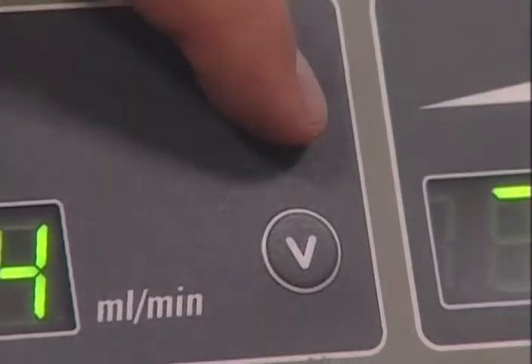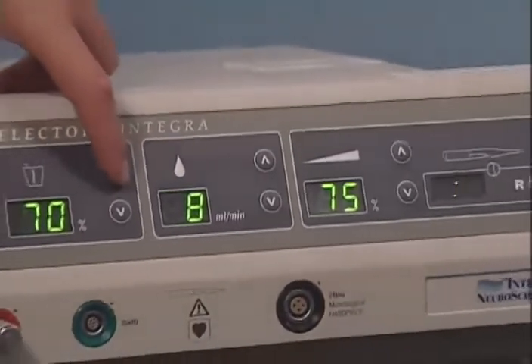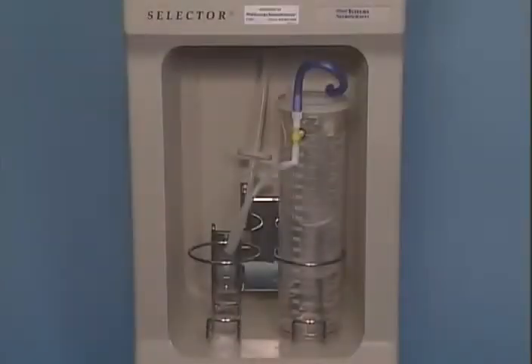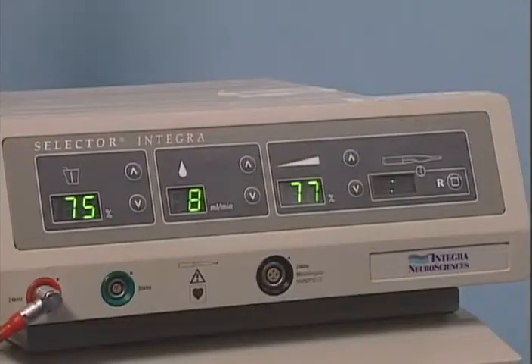The surgeon should check that aspiration, irrigation, and power are set to the desired level. These may be readjusted at any time during the operation by the appropriate increase and decrease buttons. To operate the ultrasonic aspirator, the surgeon depresses the power pedal. Aspiration operates continuously. Irrigation is activated at the preset level when the pedal is depressed, and the ultrasonic power is controlled in a linear fashion, so it increases with the downward pressure on the power pedal. At full depression, the maximum preset level is reached.